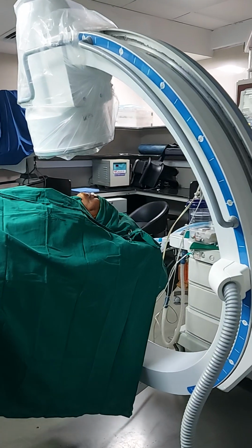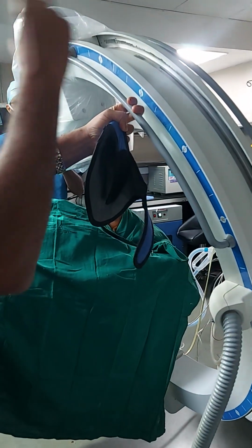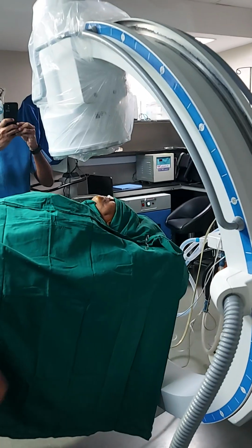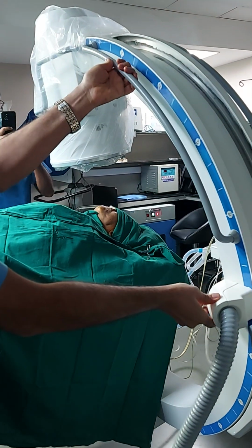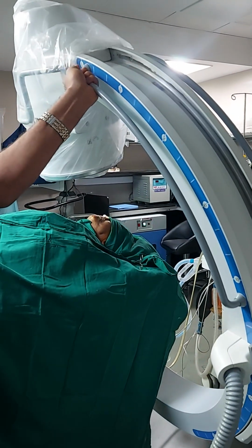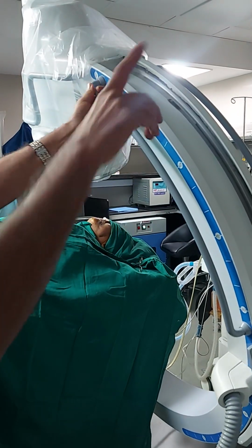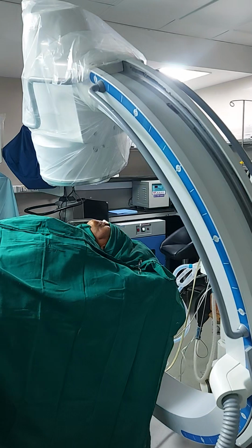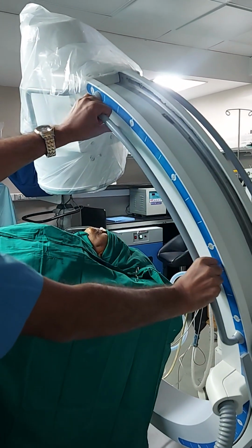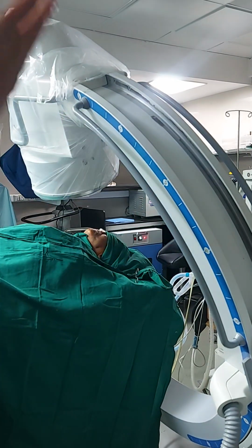Now we'll summarize. I'm in AP position, then go for the caudal tilt till you see the submental view, and then go for the ipsilateral oblique. Go on doing ipsilateral oblique till you see the space between the mandible and maxilla, and once you see that, look for the foramen ovale and try going 5-degree cranial and ipsilateral oblique slowly by the image.